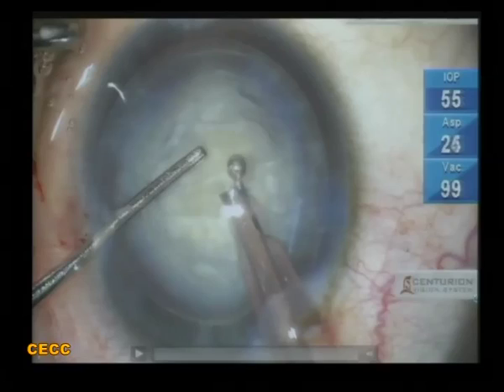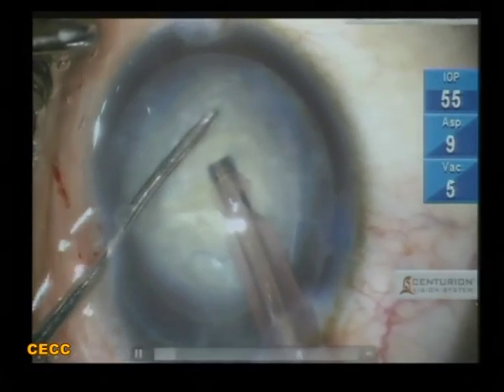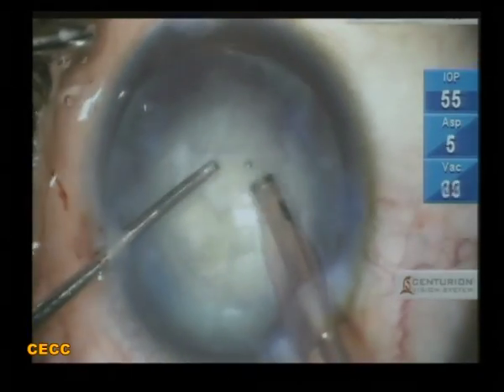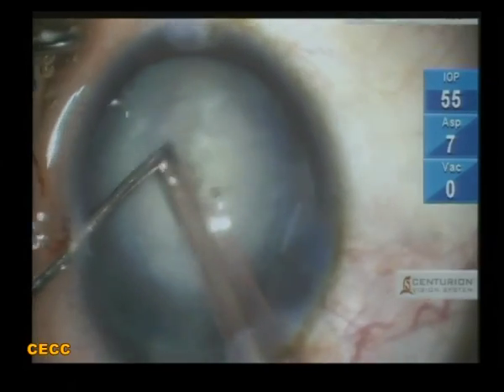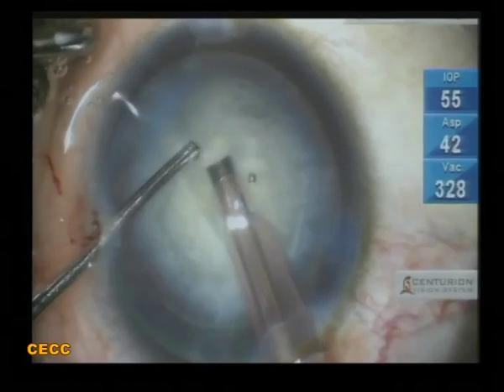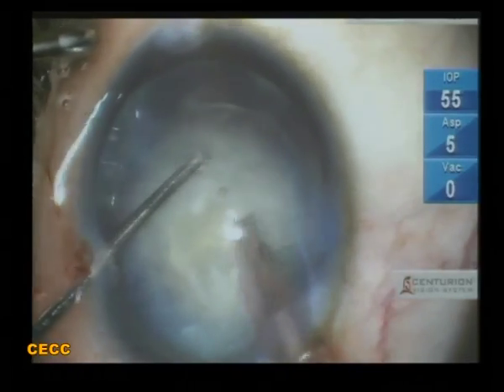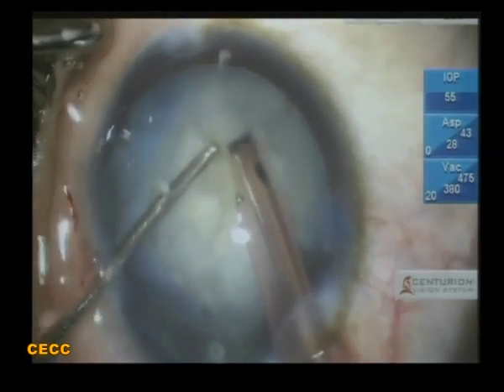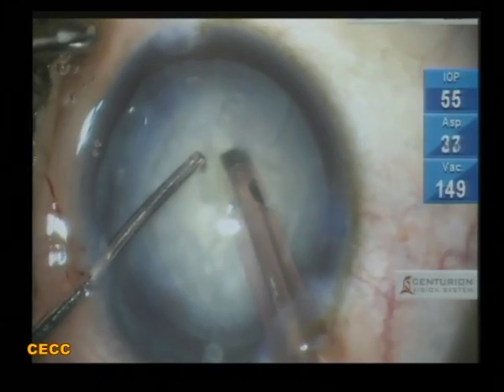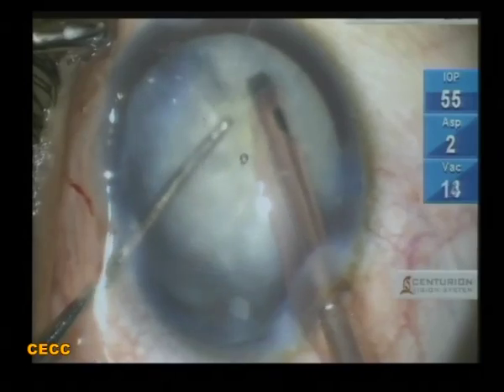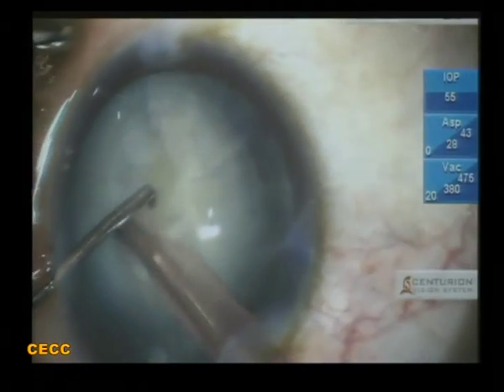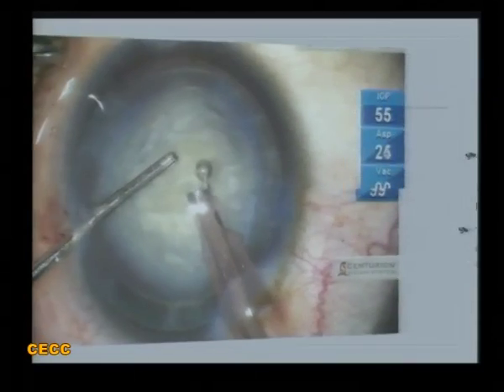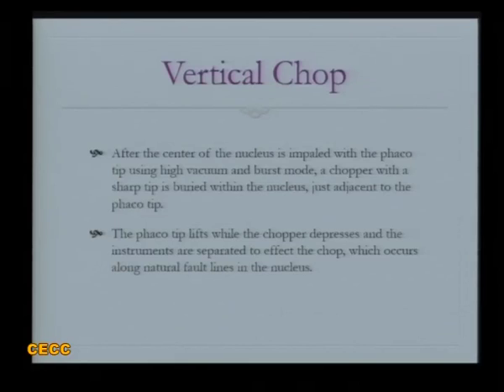The next case involves a trainee I was assisting last month — a high myopia patient. The trainee was so reluctant that they did not enter the nucleus properly, only trying to scrape the superficial part. This is one of the most common mistakes: trainees fear entering the nucleus thinking it will cause posterior capsule rupture, and they keep scraping on the superior part without going to the proper depth. Once you go to the proper depth, you start getting the nucleus chopped. This demonstrates vertical chop, but it is important to impale the nucleus using a higher vacuum burst mode before starting the chopping.